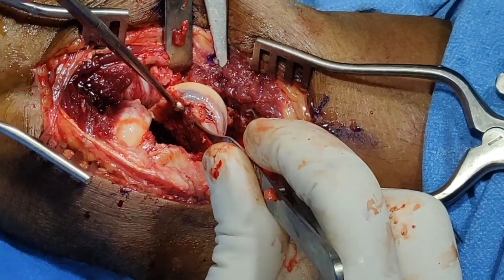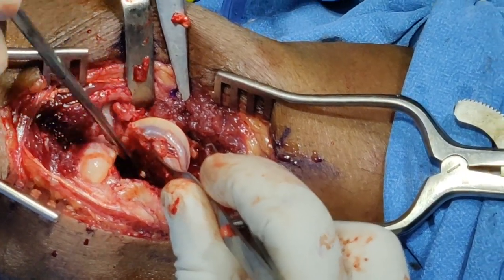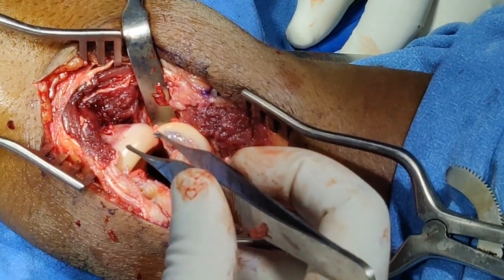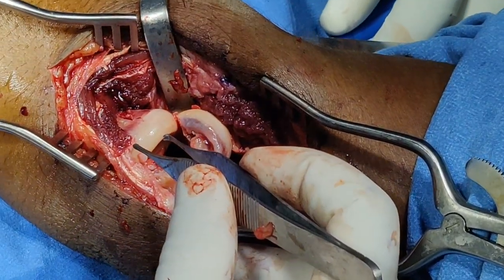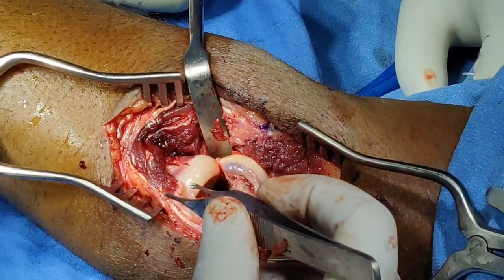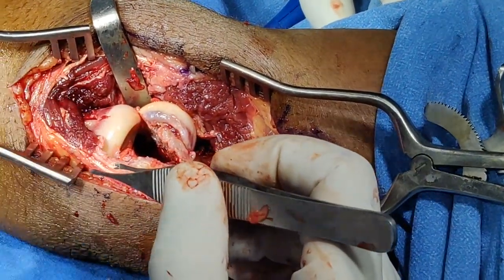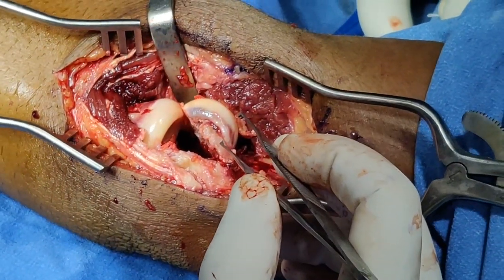This fracture is two weeks old so it will be a bit of a struggle to reduce it anatomically, but hopefully we should manage. One useful tip: keep the arm pronated and do not place any retractors — especially humeral retractors — across the radial neck, as this risks causing compressive neuropathy of the posterior interosseous nerve. Avoid using any retractors over the radial neck.